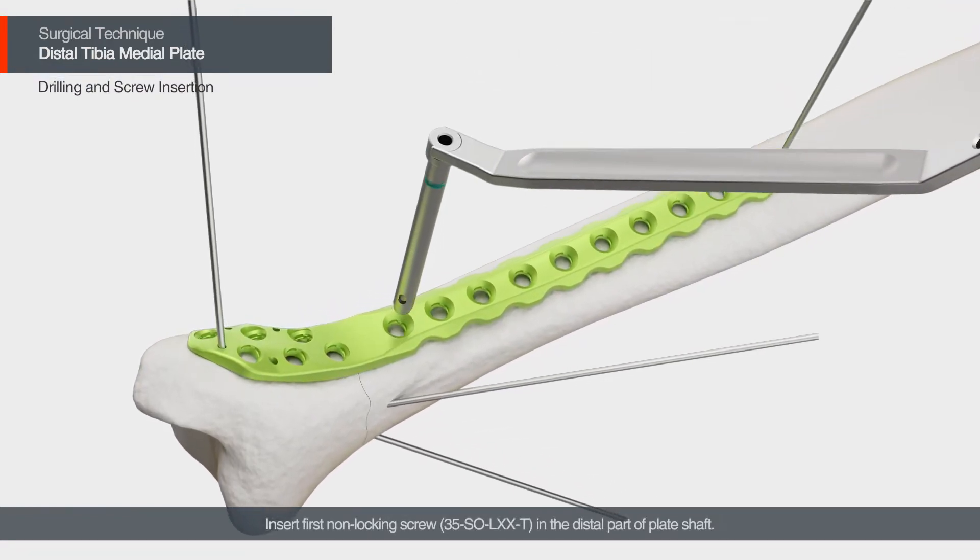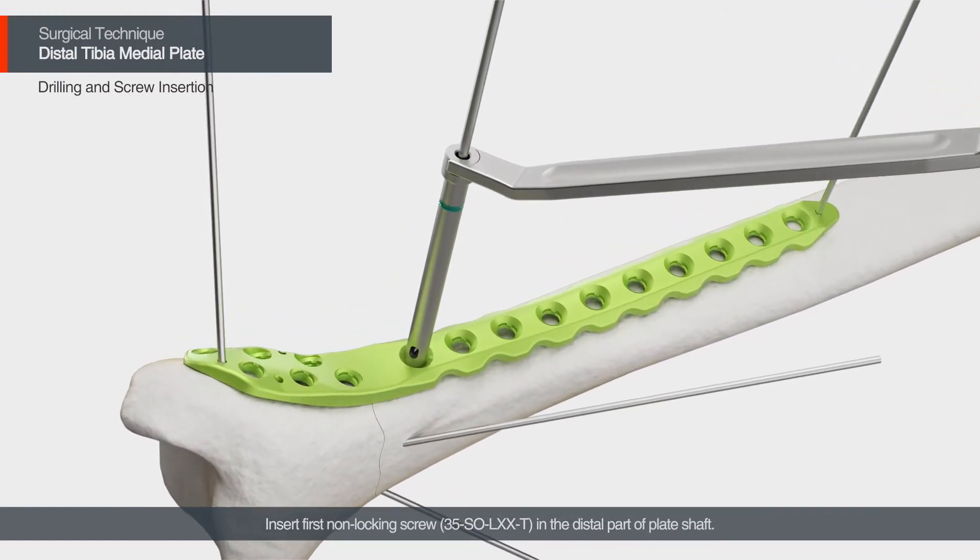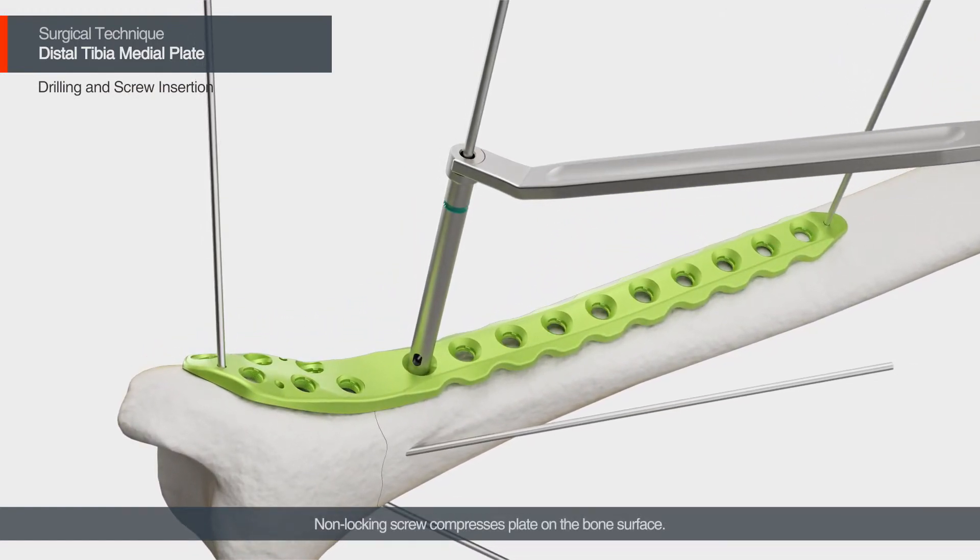Insert the first non-locking screw in the distal part of the plate shaft. The non-locking screw compresses the plate on the bone surface. To adjust plate position, use the oblong hole in the plate. For pre-drilling, use the drill guide and drill bit.